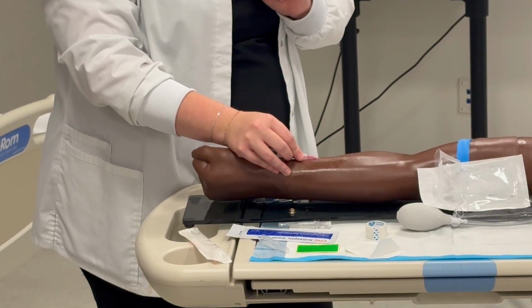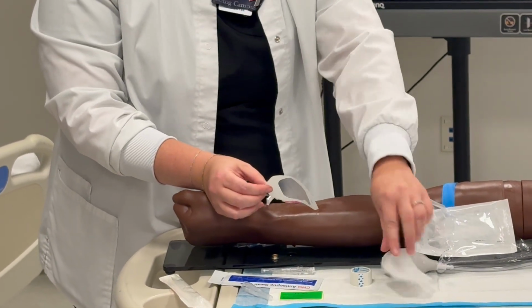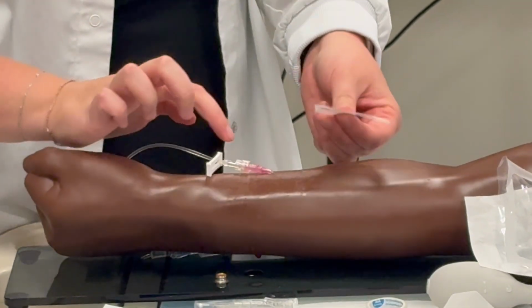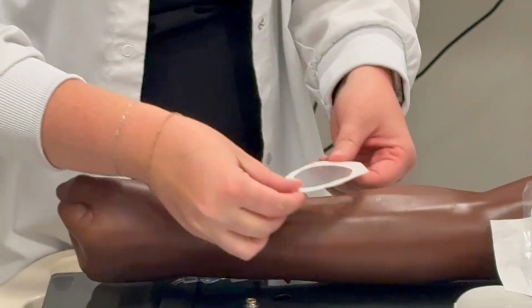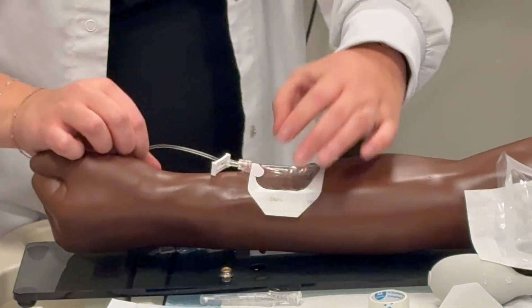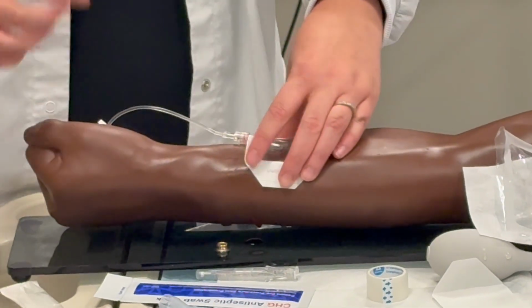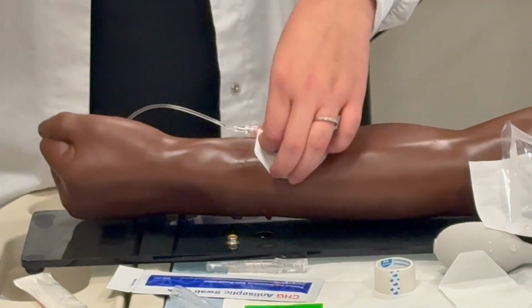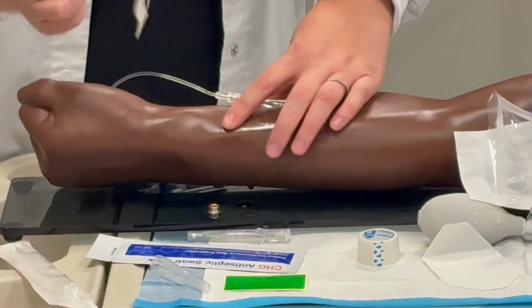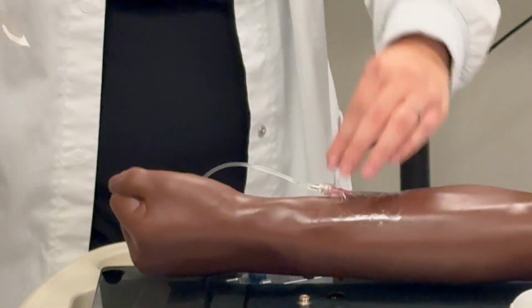it's flushing easily. So now I'm going to get my transparent dressing and put it on my patient. We don't want to cover where the pink part screws in to the clear part. And that's because if we want to get access and remove this, we aren't accidentally peeling out the IV too, okay? This white part comes off. You want to label your site with date, time, and initials.